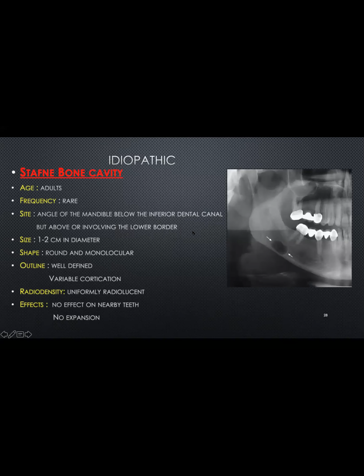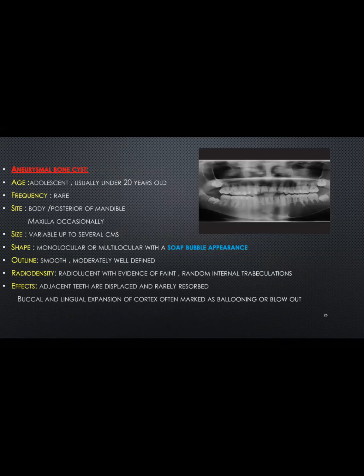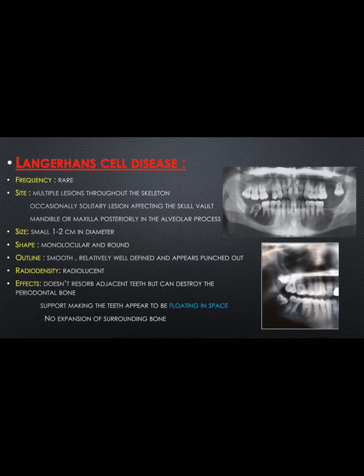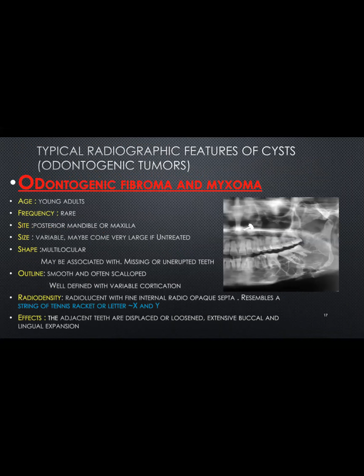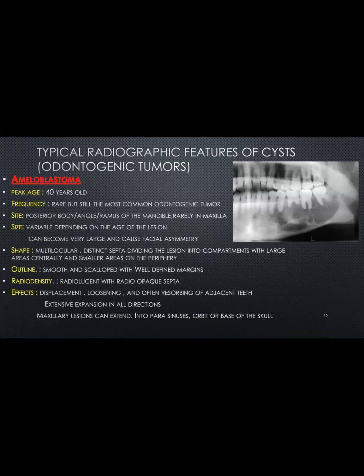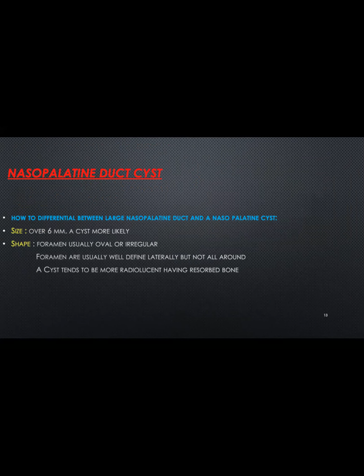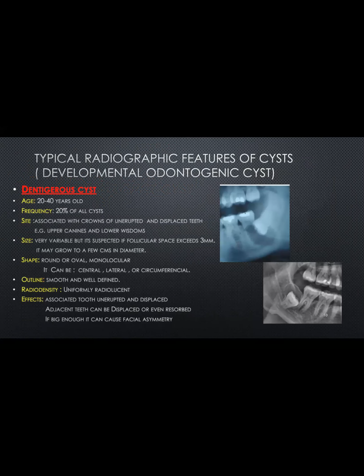I just want to add one thing. When you were talking about the classification of the radiolucent lesions, and you spoke about epithelialization, you cannot notice epithelialization on radiography. You notice cortication, and that's an indication for cysts rather than epithelialization. Epithelialization is a pathological finding, versus cortication is a radiological finding. I do believe you have some questions.